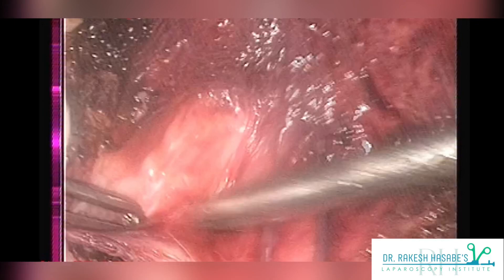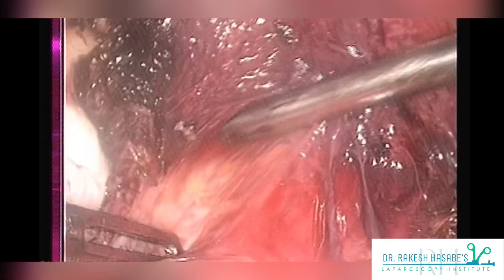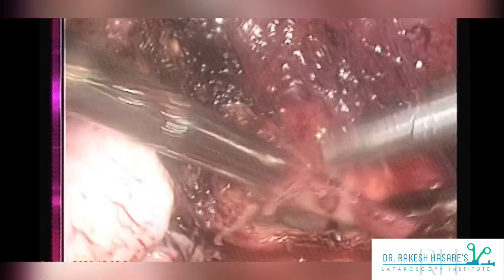You can see how smoothly the bladder fibers are getting pushed downwards just by a gentle traction. Once you get rid of all the bladder fibers out of your way, then you can start performing your laparoscopic vault suturing.